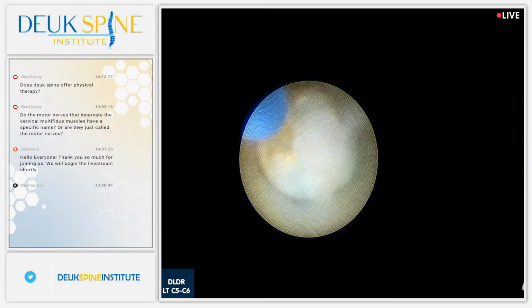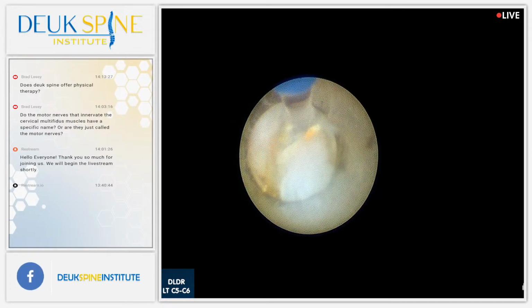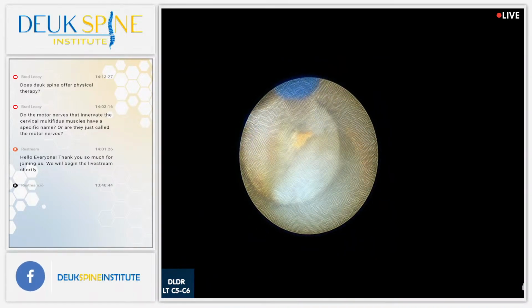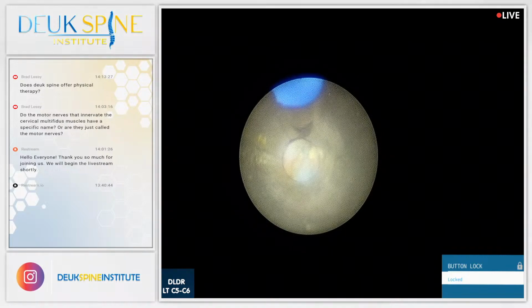It's a little too bright. How do we bring the brightness down? I'll bring it, if you're okay with me. I want to bring one click down. It's a bit, we call it overexposed. All right. There's another piece of herniation.